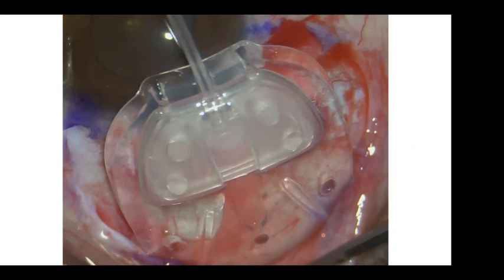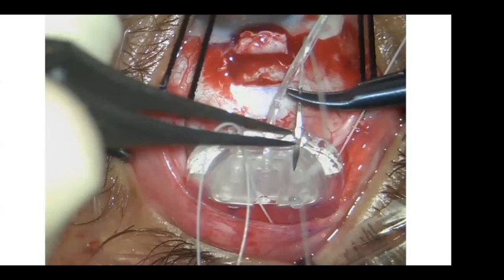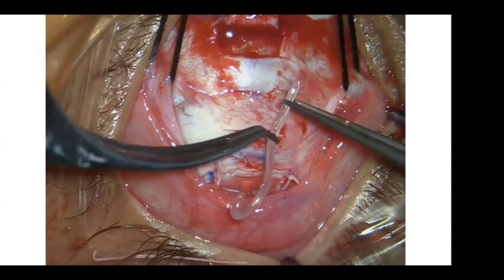The artery forceps, especially curved on the sclera, I open, and it will help the separation of the Tenon's effectively. And the good point is that the implant will go smoothly. And here, the pre-placed sutures I place, so that I put the sutures on the implant while I see everything before I'm working posterior.